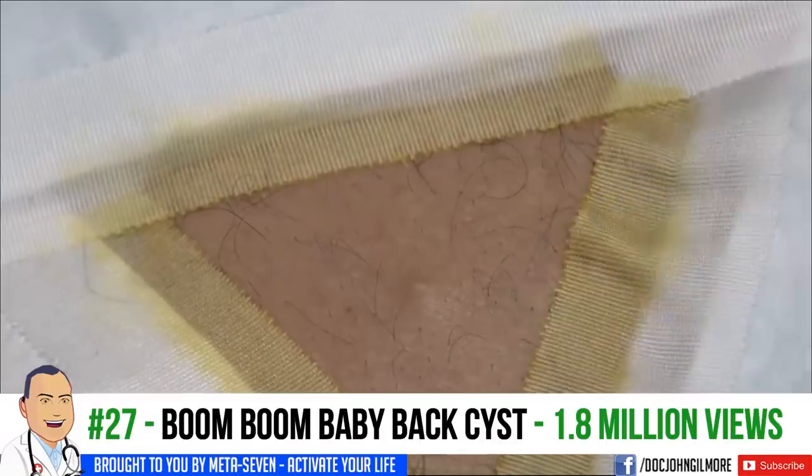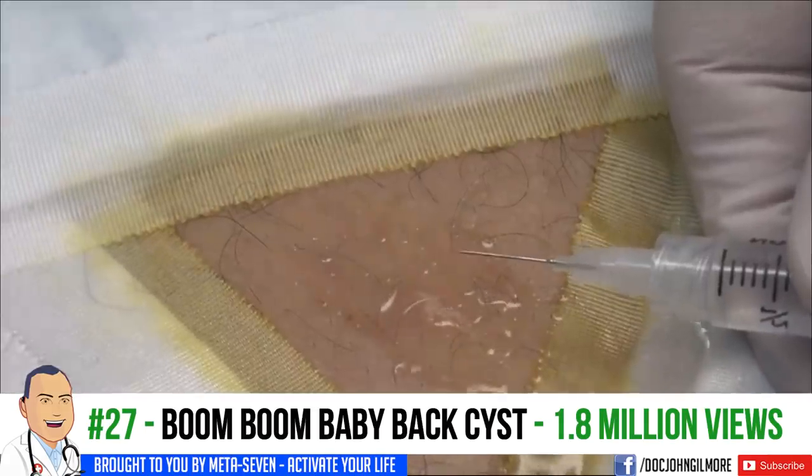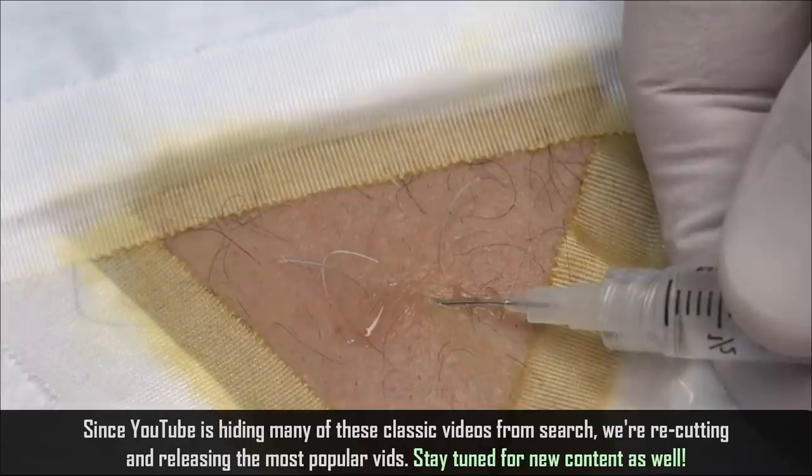Then we got Boom Boom Gonzo. A little cold spray. You're about to feel a stop, stop, stop. Good. You're about to feel a little stick, my friend. Stick, sting, and a burn.